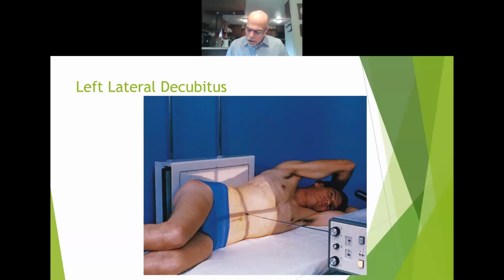let's see, position the patient so that the level of the iliac crest is centered to the IR. So again, you're at iliac crest. You can see the soft spot right there. You see this is the curve of the greater wing, the ala. This is the inferior angle right here. Okay, here we go. Right here, you can see that little caved in area right there. So that's the soft spot. That's L4, and we're still at MSP. Central ray is directed horizontal and perpendicular to the midpoint of the IR.